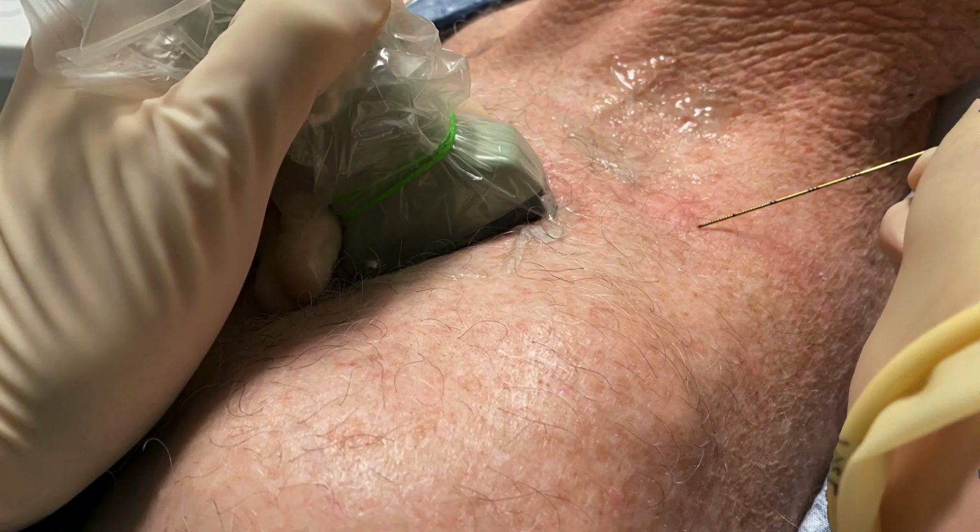Stimulation. So as I'm bringing the needle across underneath the clavicle like this, I rest my hand on the supraspinatus fossa, and if the needle were to get quite close to the nerve, we'd feel a twitch of that supraspinatus muscle. We don't actually get this very often. It's quite rare. The Raptor's a pretty safe block, but that's a hedge against the criticism of that particular block.